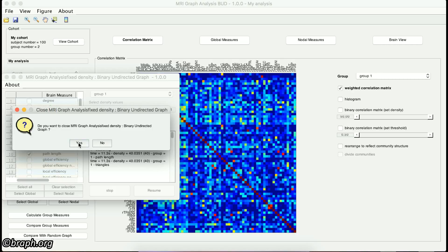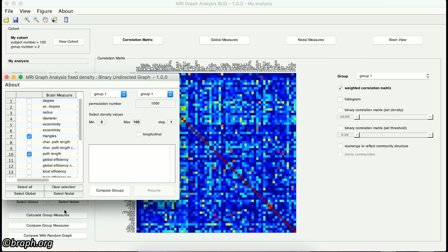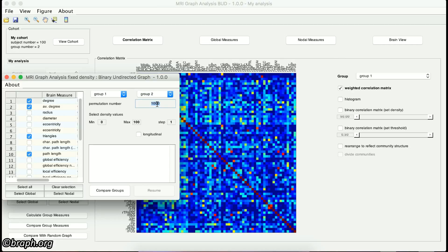If you want to compare two groups of subjects, you should click on the Compare Group Measures button. Again, an interface similar to the previous one appears. After you have selected the measures that you want to be calculated, you should choose the groups that you want to compare. Then type in the number of permutations for the permutation test. And finally, define the minimum and maximum density and the step size. In the case that the comparison is between longitudinal data, click on the Longitudinal checkbox. To start the comparison, click on the Compare Groups button.